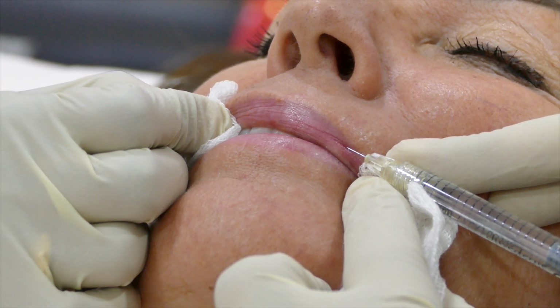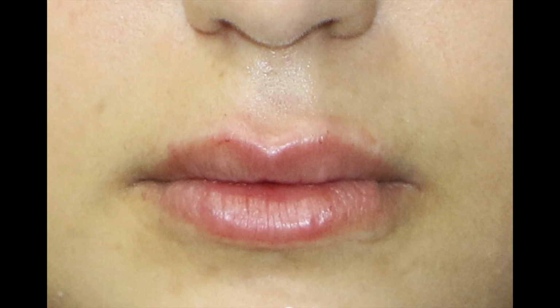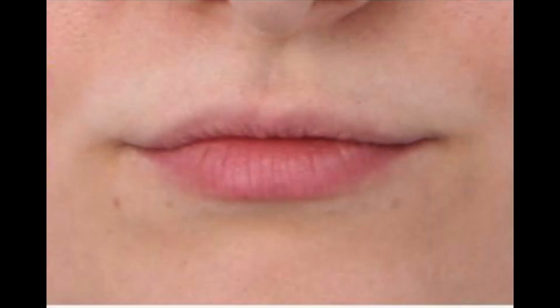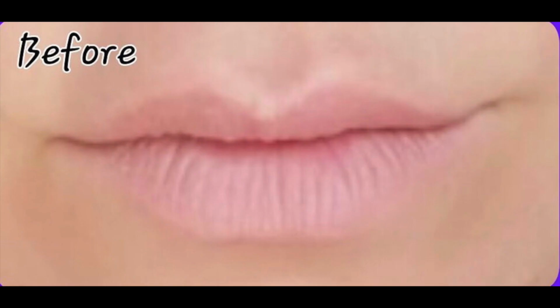These different filler techniques can be used for different indications to achieve different results. For example, in this patient, it's more of contouring to enhance the cupid's bow. In this patient, it is generally to improve the volume and to improve the looks of the mucosa. And again, improving the quality of the mucosa along with some enhancement of the volume.